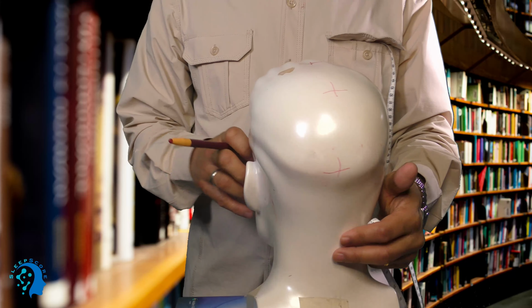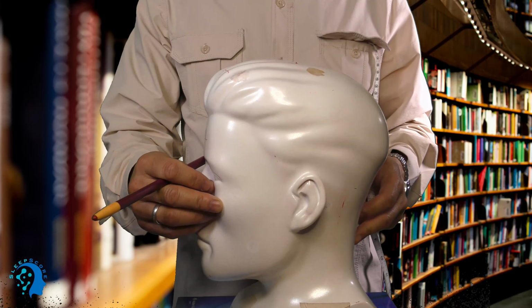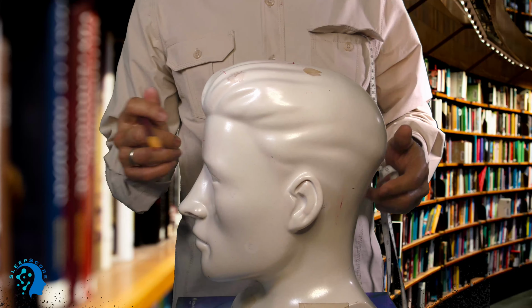So the easiest way, just like I told you, when we measure from Nasion to Inion, make it half. And after that, you go 10% up on the back. And then from half, go 20% on either side, okay? This is how we're going to measure. So this is 10-20 for the z-axis.